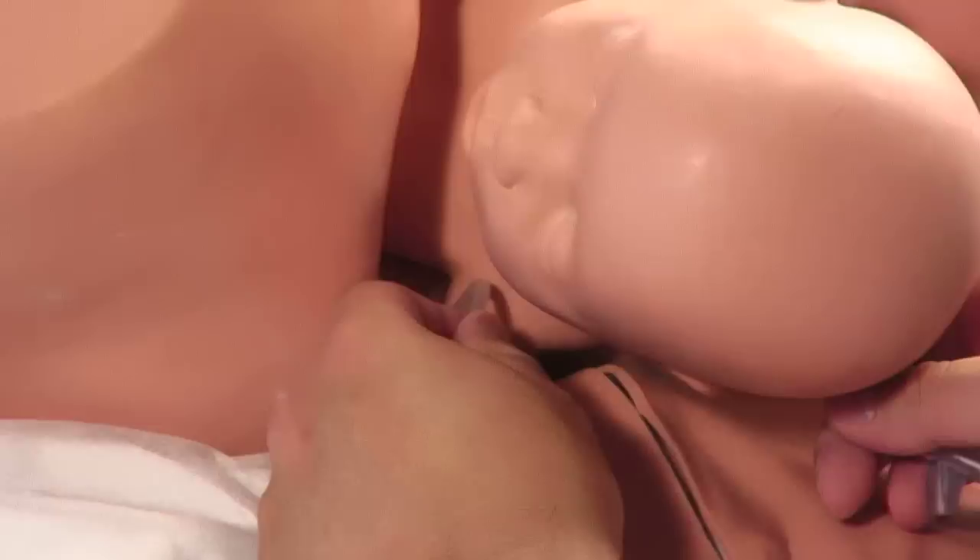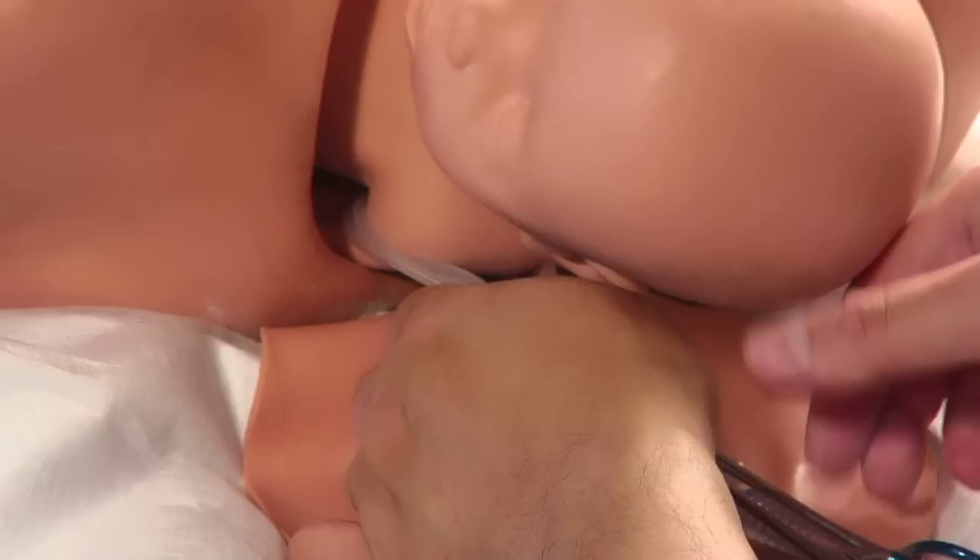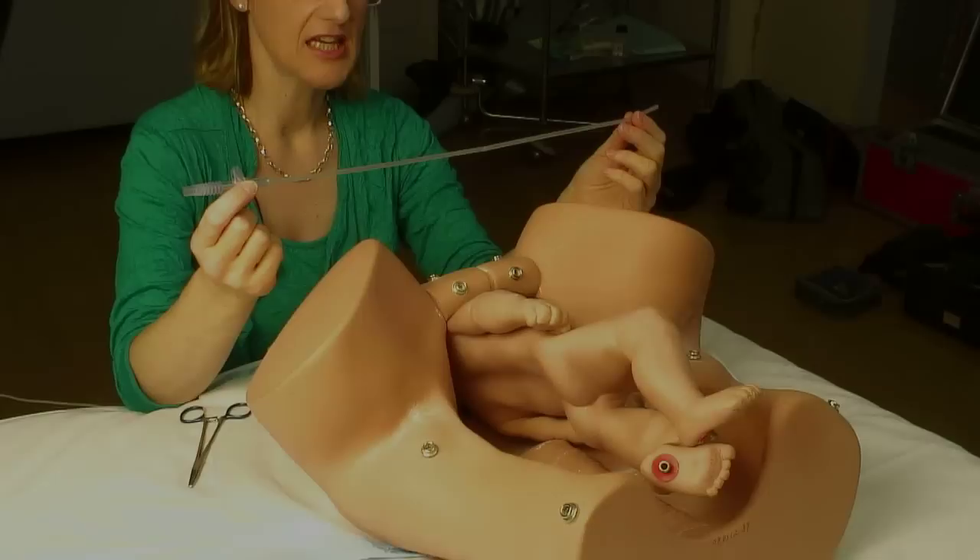This creates a double loop of plastic underneath the baby's posterior shoulder. You use that with traction, either using your hands or using a clamp, to draw the baby's posterior shoulder down through the pelvis and out. The anterior shoulder should follow through.